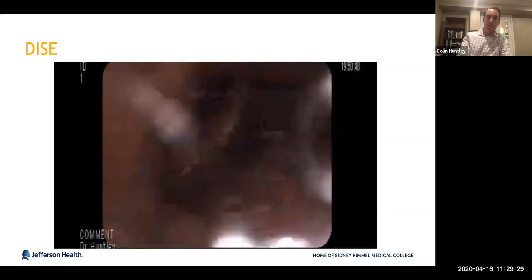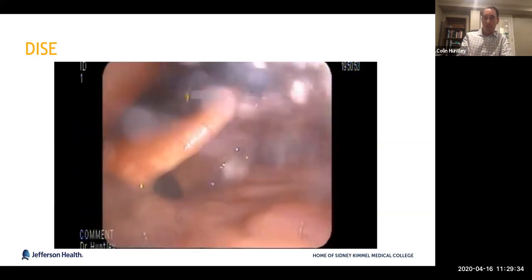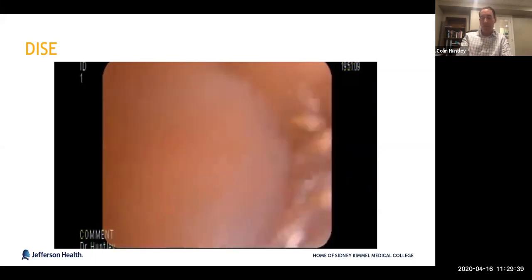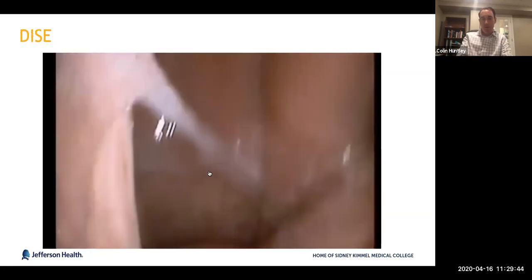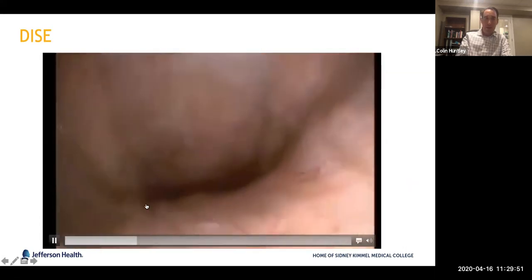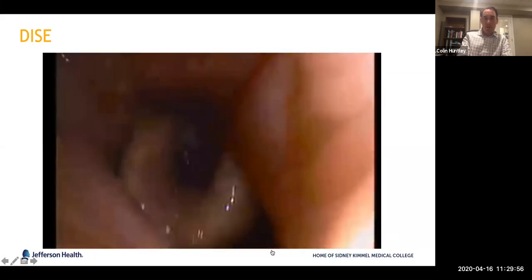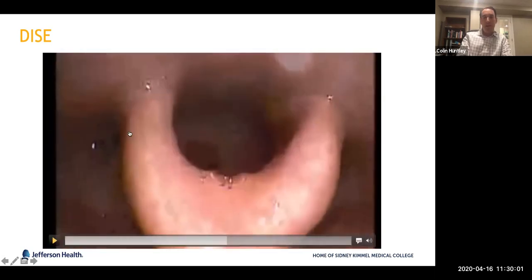So this is someone who's probably not going to do very well with a nerve implant, but we certainly do have other options, alternative treatment options to manage their sleep apnea. They're not relegated to CPAP for the rest of their life if it's something that they are not able to tolerate. And this is just another video, again, same orientation, but you're seeing this anterior posterior of the palate here. And if you see a line or almost a banana shape, and I'll go back and point that out, that's consistent with AP collapse.